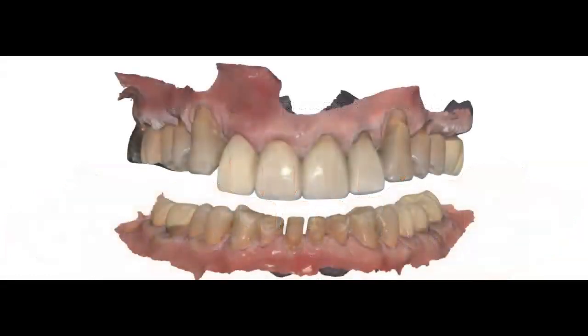Now again, I'm showing you the full upper scan and lower scan, and I want you to see that not only has the patient had a slow but progressive attrition and erosion of the mandibular incisors and the canines, but he has also had over eruption of maxillary incisors going from 7 all the way to 10. If you look at the incisal edge position of 7 through 10 and compare it to the incisal or cusp position of 6 and 11, you can see how much these teeth have also over erupted. Why? So that they can compensate for the interocclusal contact that needs to be established.